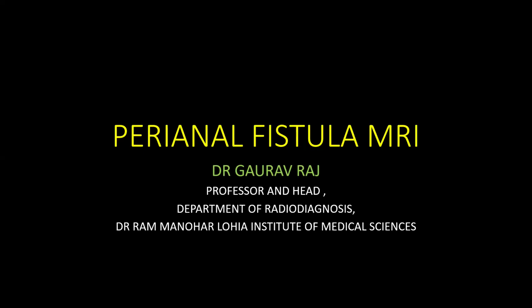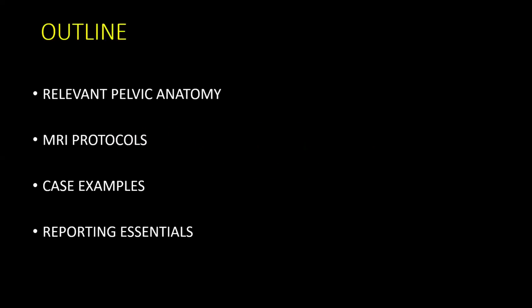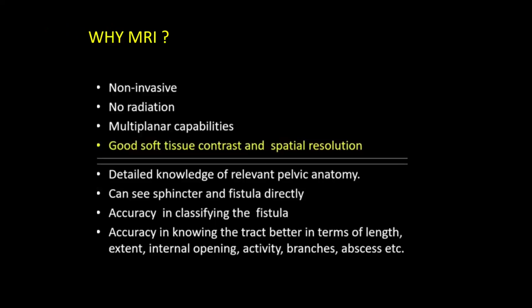Okay, so perianal fistula. There are few topics in MRI where the surgeon is actually dependent upon us, and we should exploit this, right? So today's seminar would be under these outlines. I'll talk about relevant pelvic anatomy because I cannot go ahead until I give you a clear description of the pelvic anatomy. Then we'll talk about MRI protocols, show you some case examples, and end with reporting essentials, what you need to know.